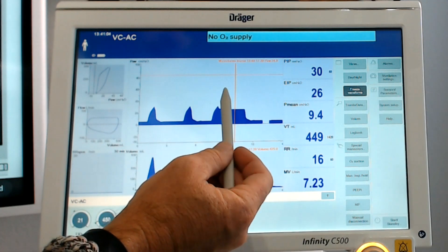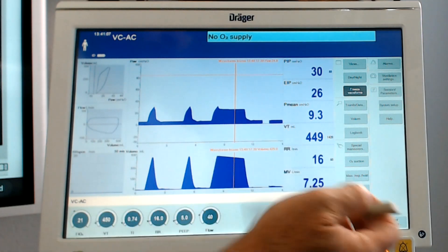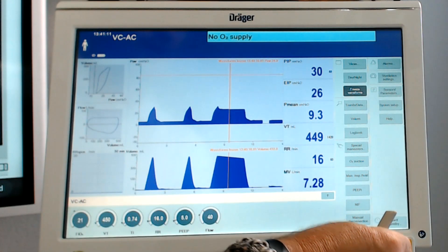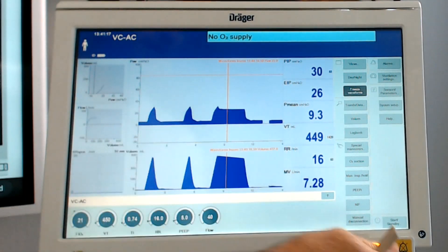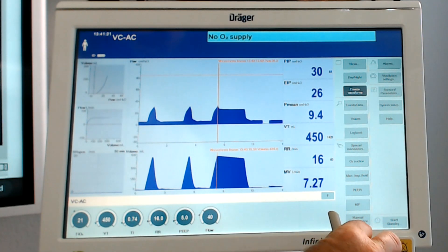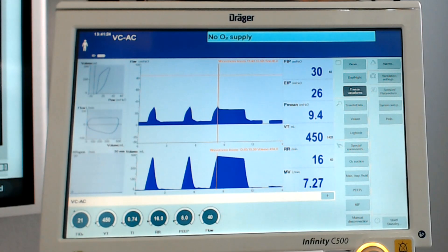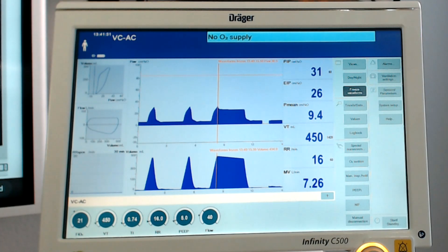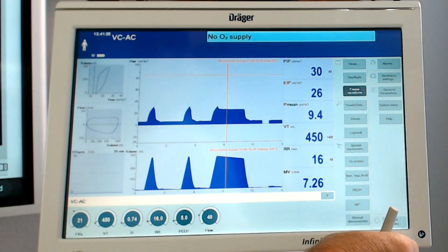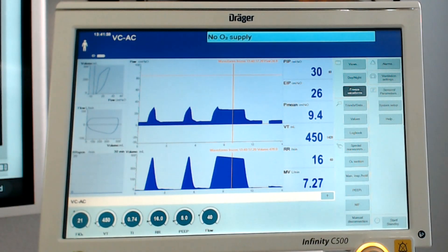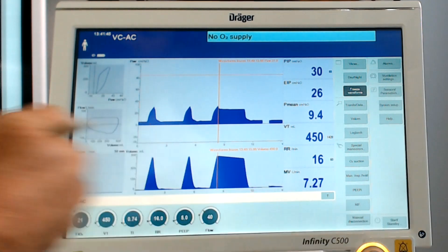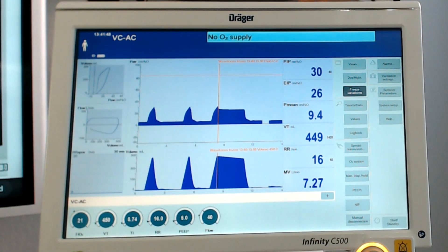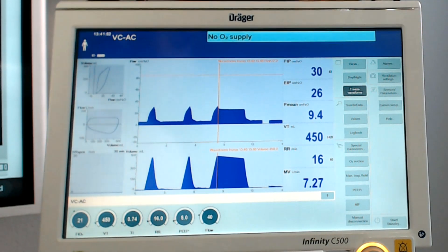Moving my cursor here, I can see that my airway pressure during the plateau is reading 24.8, 24.9, 25 — so our plateau pressure is 25 cmH₂O. Our peak inspiratory pressure was 30.5, so we'll round up to 31 cmH₂O. And the peak volume delivered was right at 450 milliliters. That's our baseline starting point.